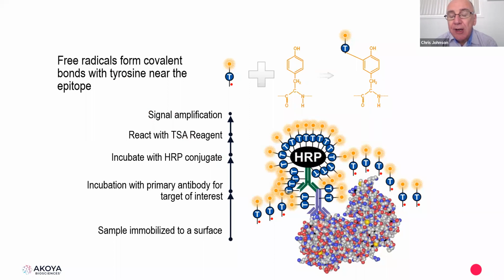Now, it's very limited in its distance. There have been studies done, particularly with electron microscopy, where they find it's only a few nanometers, basically, away from the site of binding. Okay.